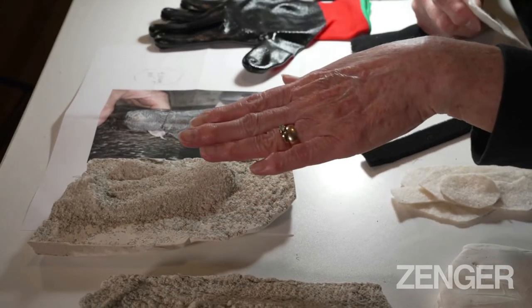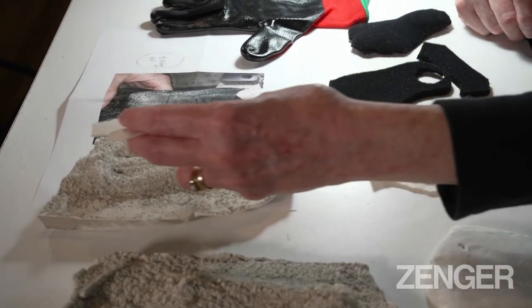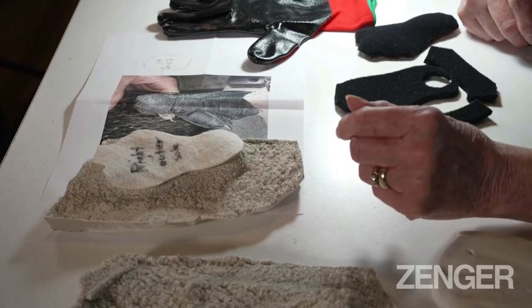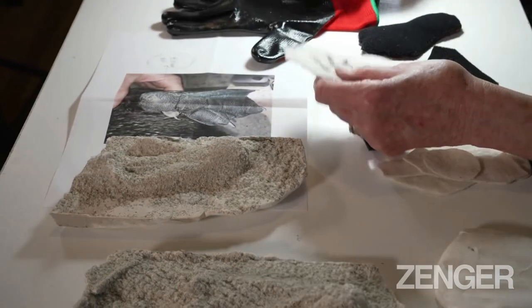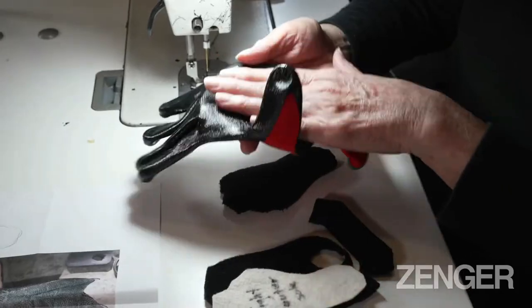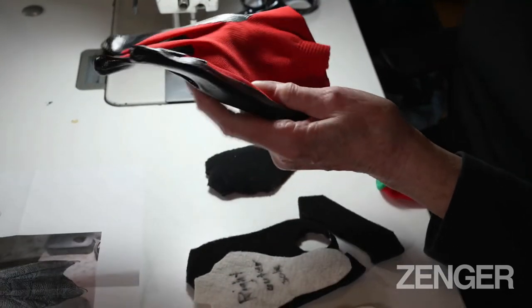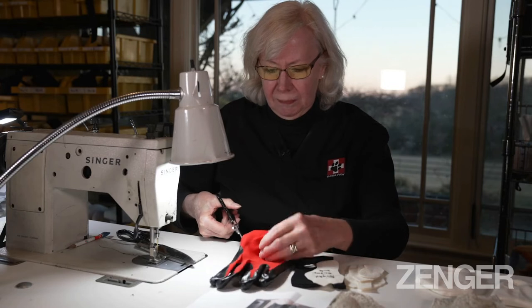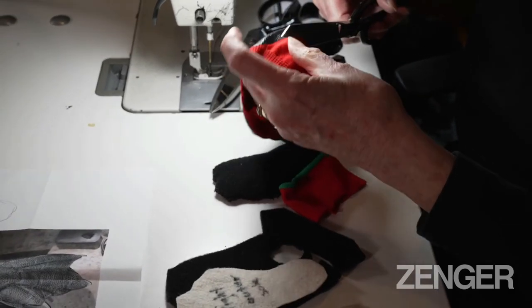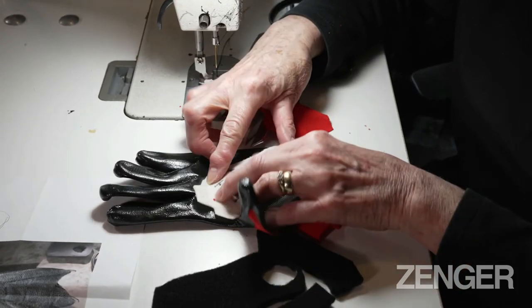He walked in sand, made an impression, and then they put plaster in the footprint, and it hardened — and this is what we get to work with. Based on this, we make a pattern of his right foot — that's the sole. Then to make the sole, we take a garden glove which has a textured rubberized palm, but the palm is what we use to make the sole of the foot. We just cut away the red part which we don't need, and open out the sole, and then the pattern goes like that.